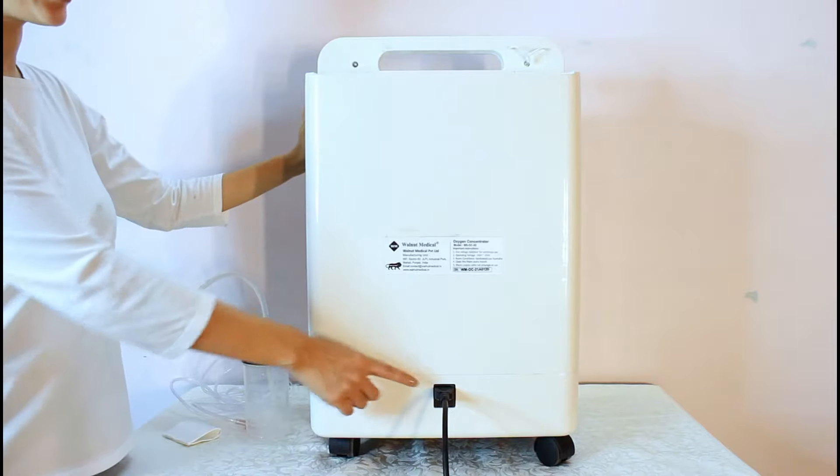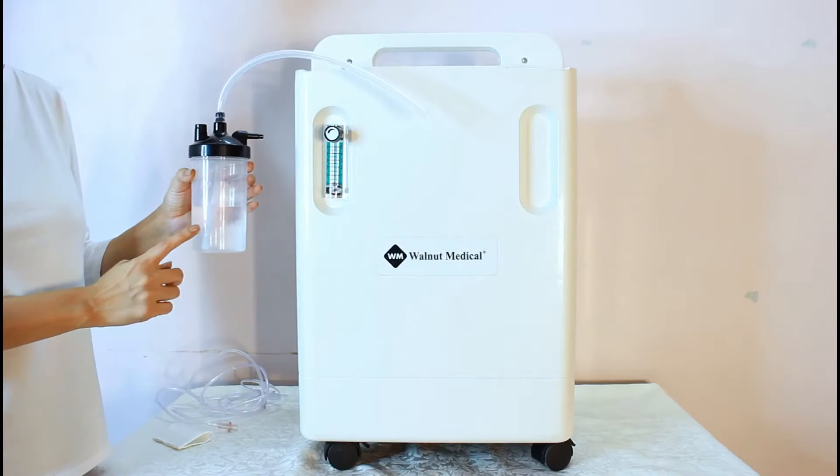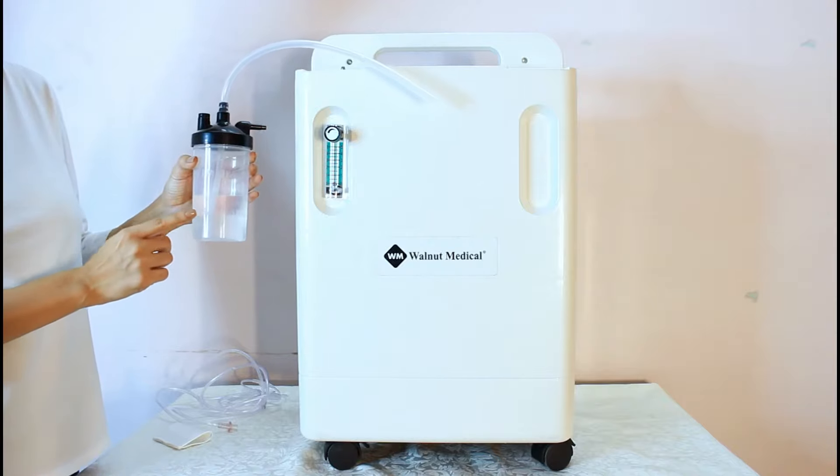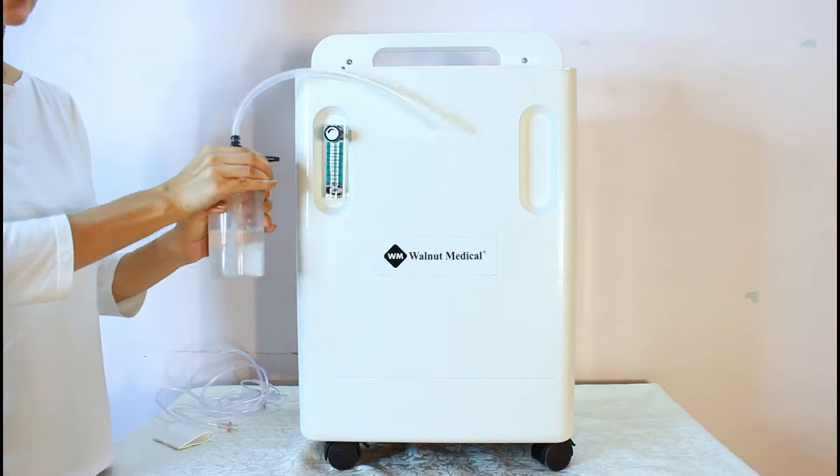Step 1 is to plug in the power cord. Put cool water in the humidifier bottle. The bottle is marked with the minimum and maximum level of water required. Make sure you secure the lid tightly.